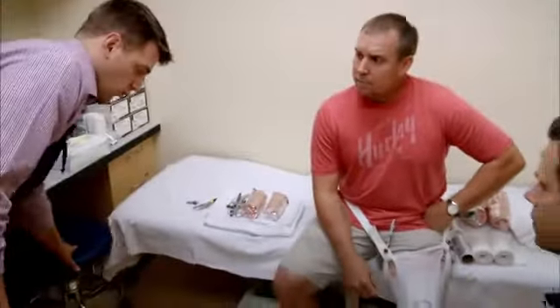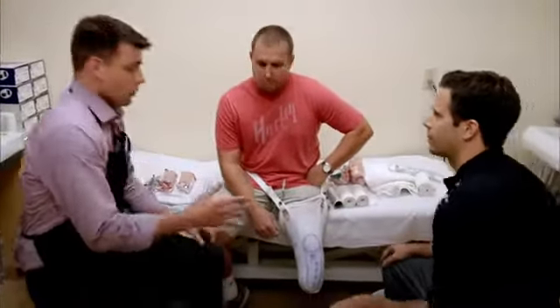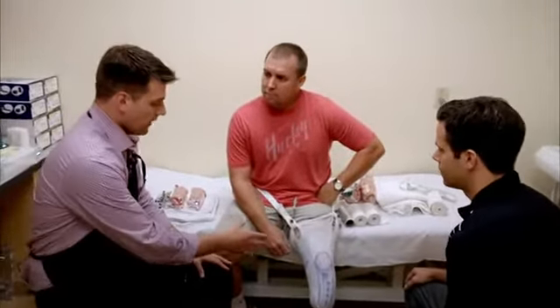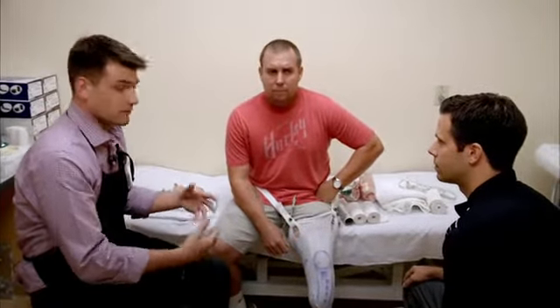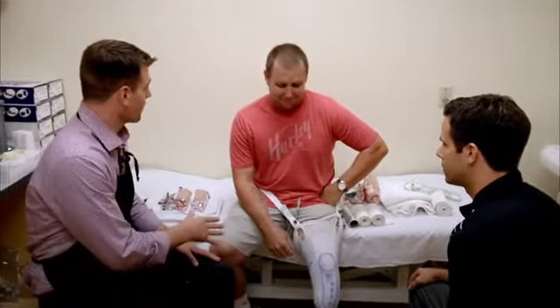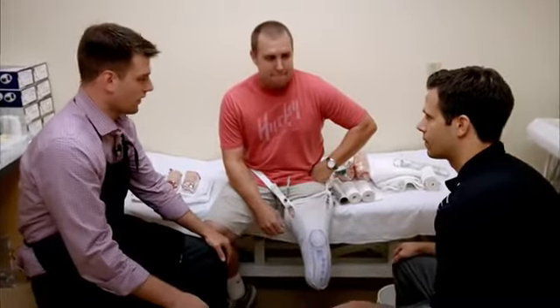Brian's here with Nate Jackson, one of the prosthetic technicians who helps Wounded Warriors every day. We just came from the sewing room, and now what we're going to be doing is doing a cast on Nate. He's agreed to let me do it, so hopefully it goes better than the sewing. Brian's going to first give me a quick lesson on how to do it.